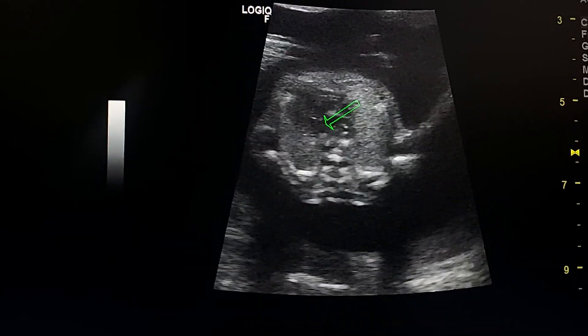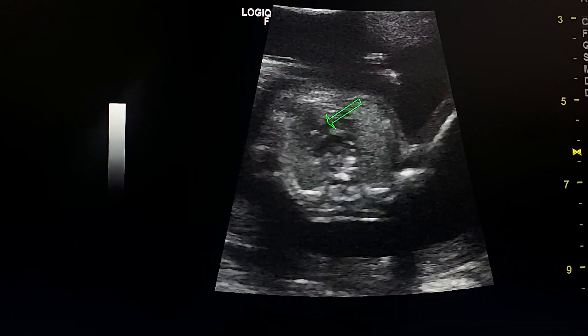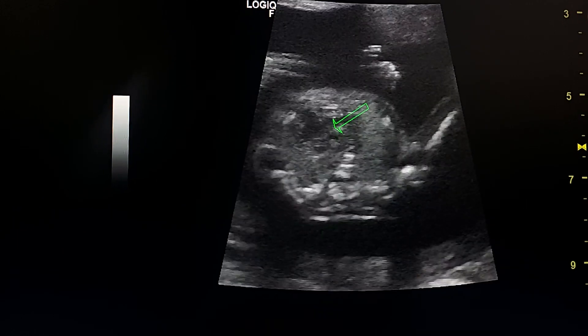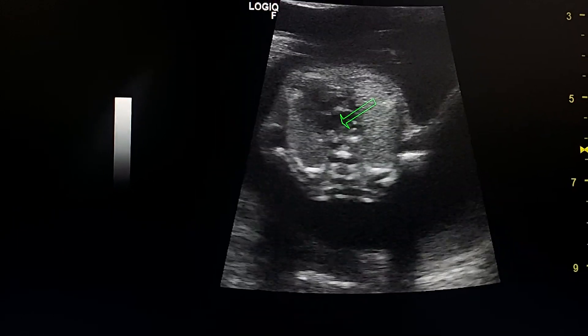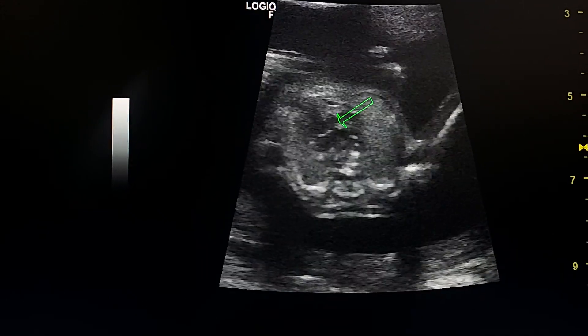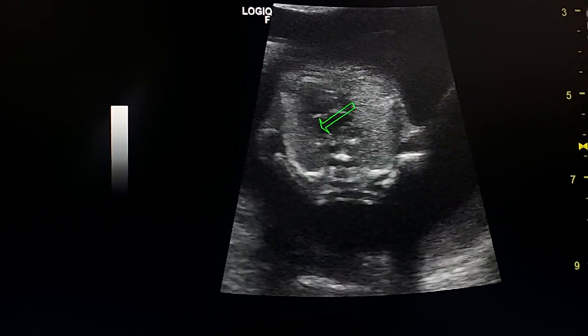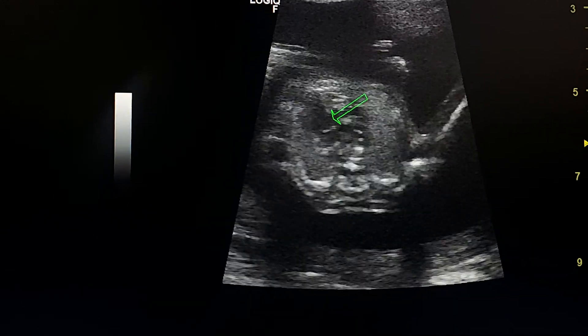The VSD is between the normal-sized left ventricle and the small-sized right ventricle. We don't see the tricuspid valve. All these findings are consistent with tricuspid atresia.